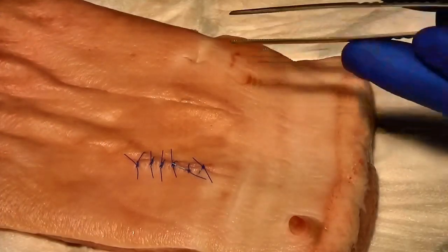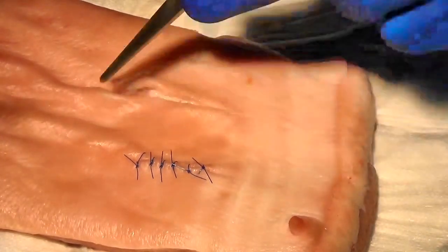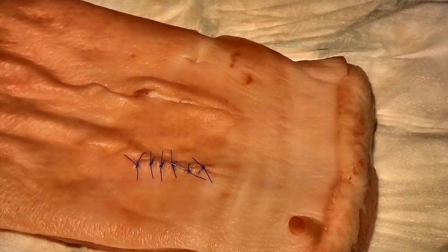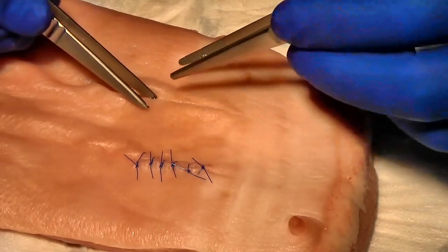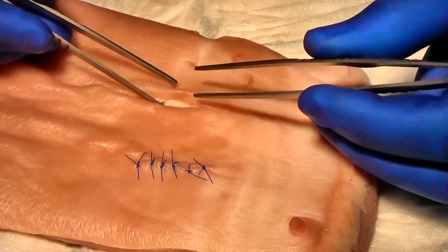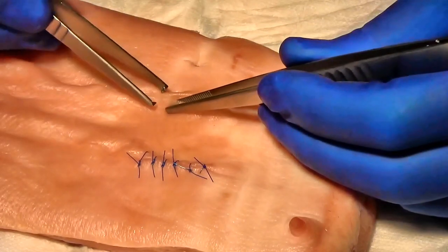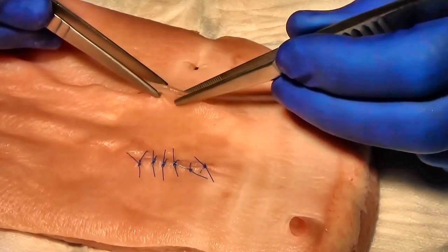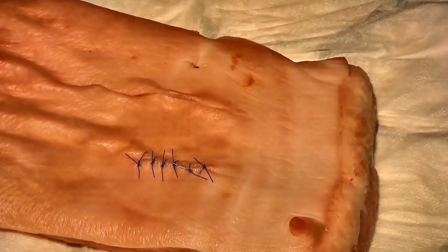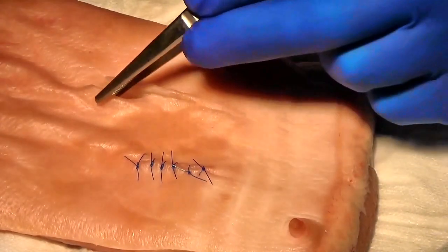We're moving on now to look at the vertical mattress suture. This is an extremely useful suture which can prevent inversion of the skin edges like this. Generally, when you're trying to suture a wound, you want the skin edges everted. If you end up with inverted edges, you have a broad, ugly scar. So the mattress suture is a very useful technique to be able to do this.